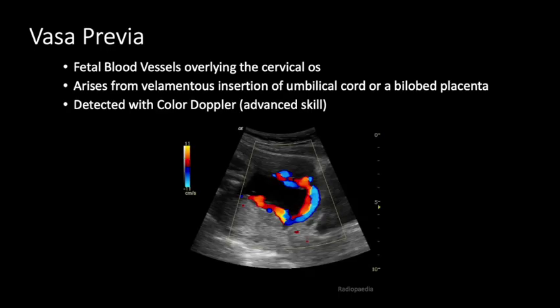This is an advanced skill that I don't expect all of our residents to know how to do. However, as part of the routine anatomy scan and then follow up for any identified anatomical challenges or anything on the placenta previa spectrum, these would require serial ultrasounds to further evaluate.